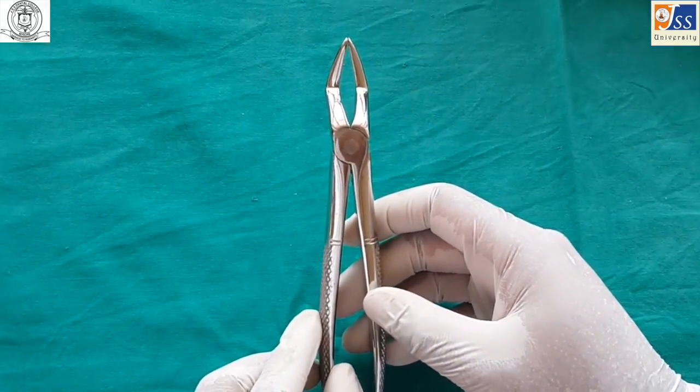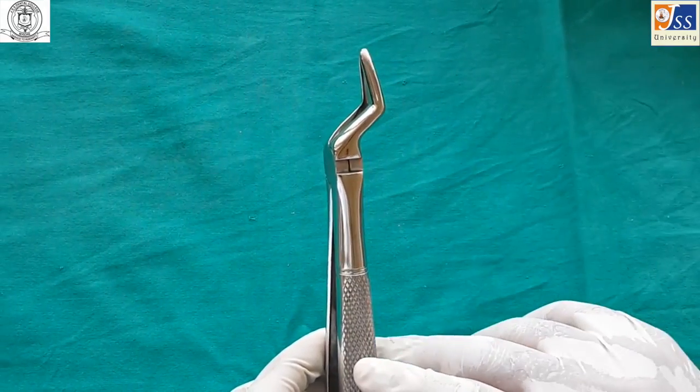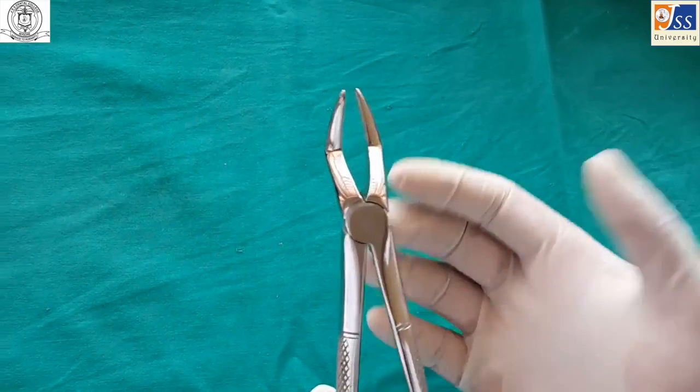Maxillary root forceps, also known as bayonet forceps, is used for extraction of root stumps. The beaks are tapered and the tips mate to get a better grip over root stumps.